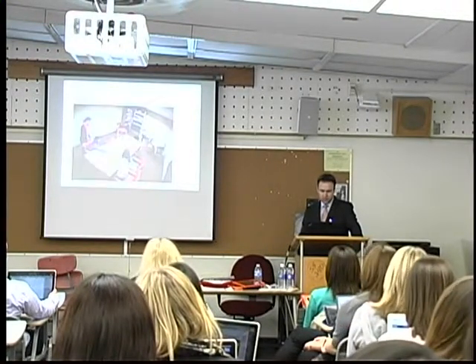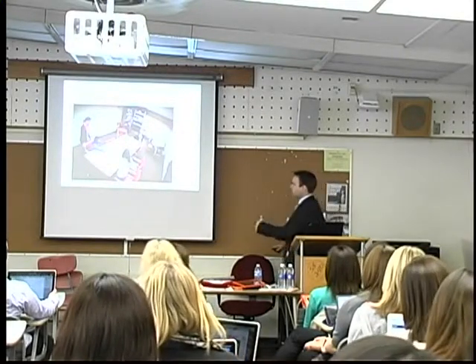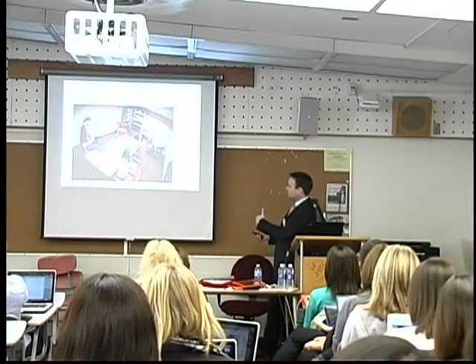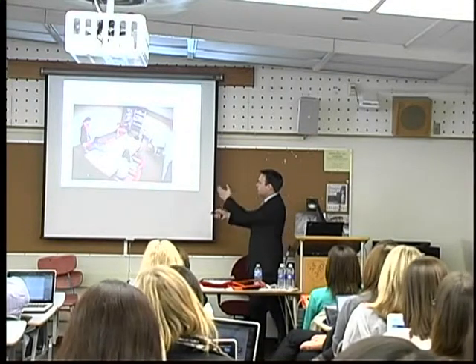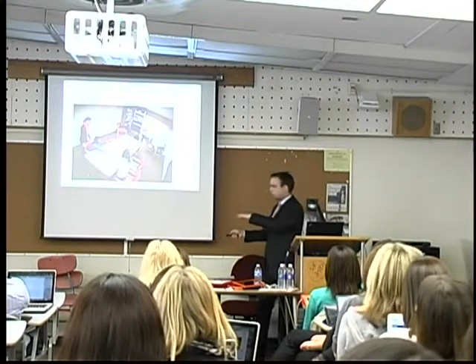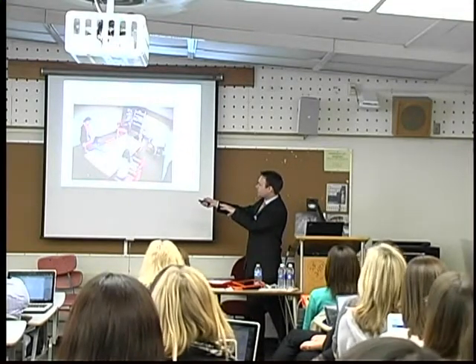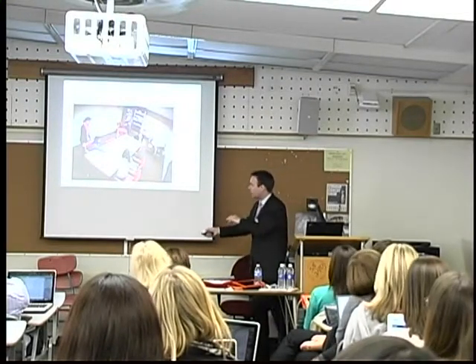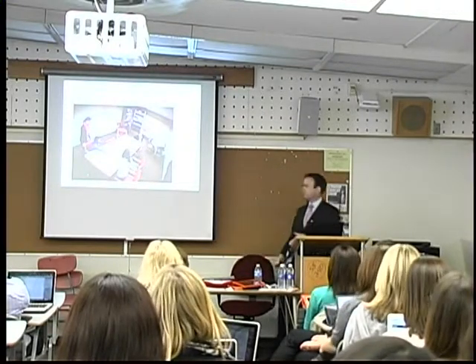Okay, so after these 2 phases, we faded in that Prox Talker. This is the first session on the Prox Talker, and you will see he is initially trying to pick up the symbol card here and exchange it for his desired item. Then she goes in and prompts him to make the correct response, which is picking up the picture card here and then putting it on the sentence strip there to have the speech output. And from there on, he gets it right every single time.